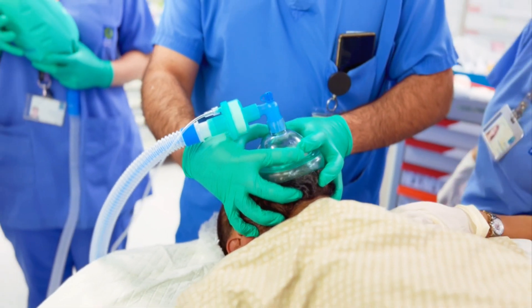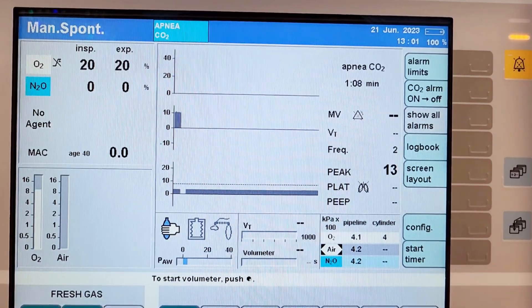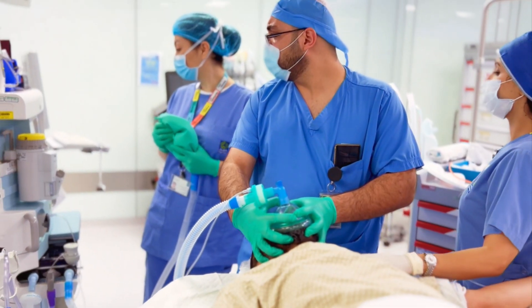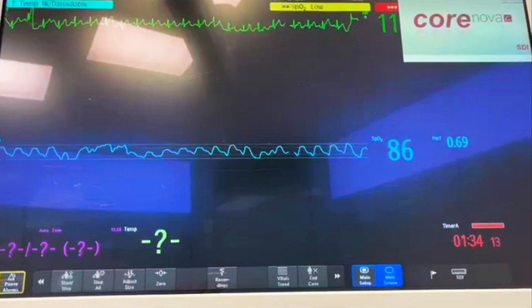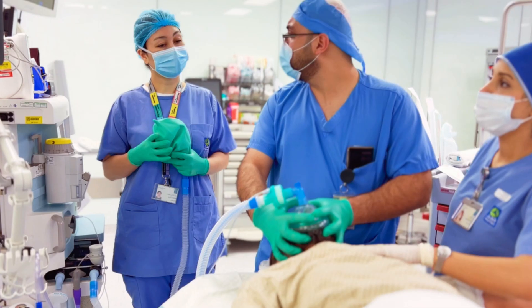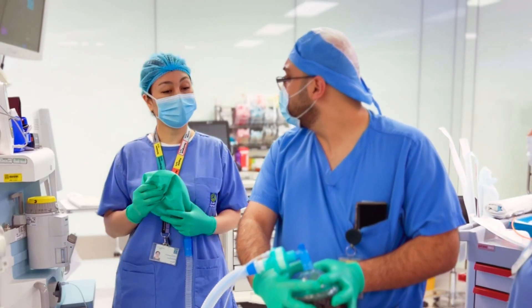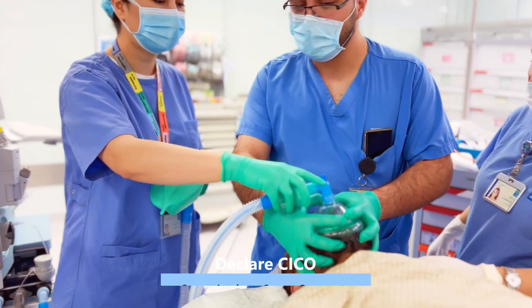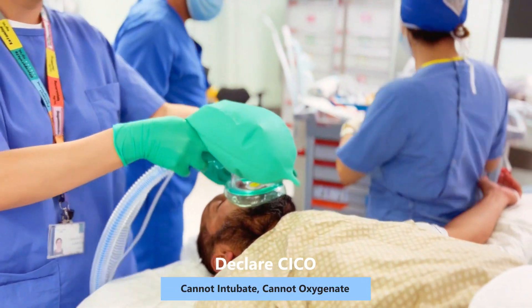A cannot intubate, cannot oxygenate, or CICO situation arises when attempts to manage the airway by tracheal intubation, face mask ventilation, and supraglottic airway device insertion have failed. The saturation is dropping. Hypoxic brain damage and death will occur if the situation is not rapidly resolved. A CICO situation and progression to front-of-neck access should be declared.